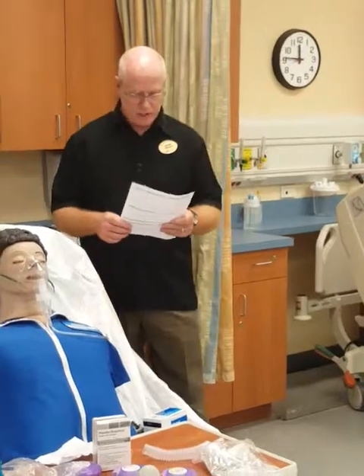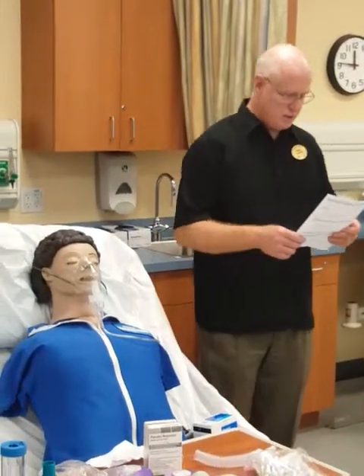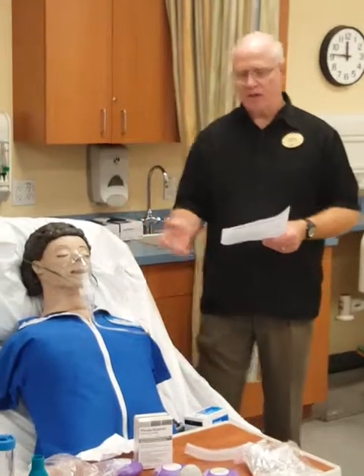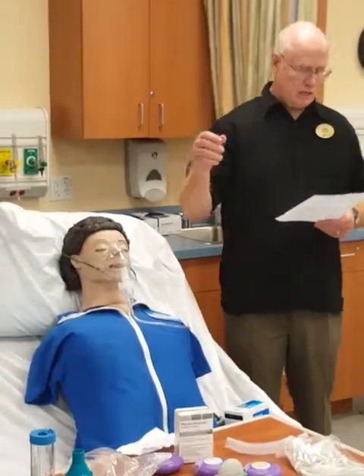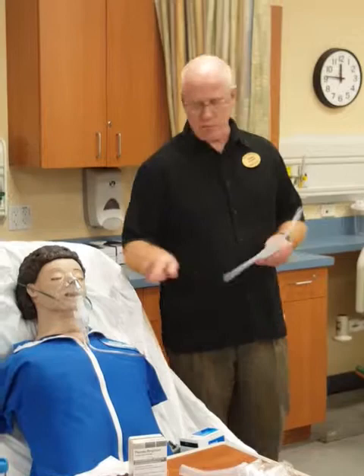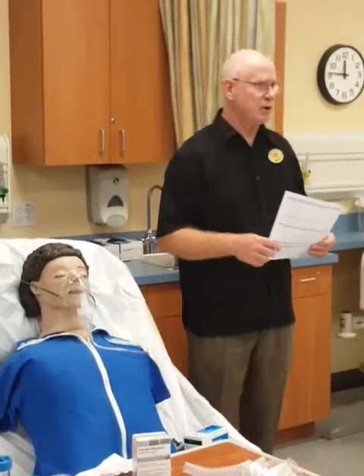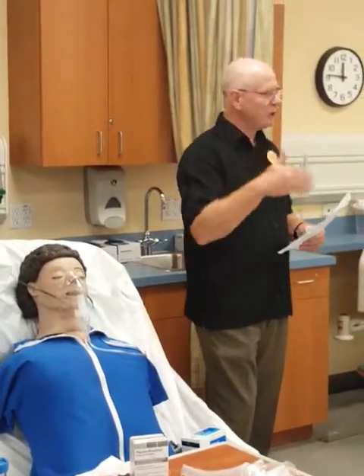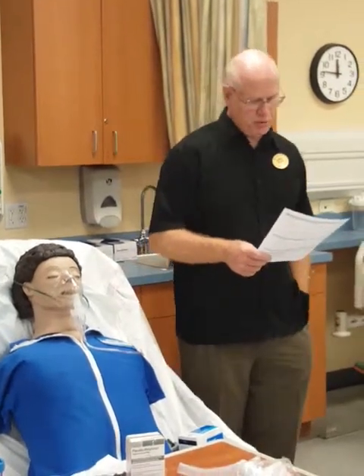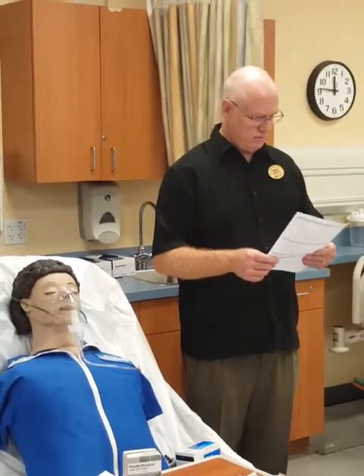Assess the vital signs and breath sounds during the treatment. You have to keep your eye on the vital signs not only before but during, because some people will have a very bad reaction to these bronchodilators — their heart rate gets going. So you'll be monitoring that during the treatment.